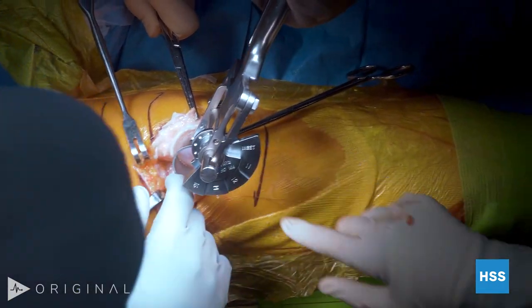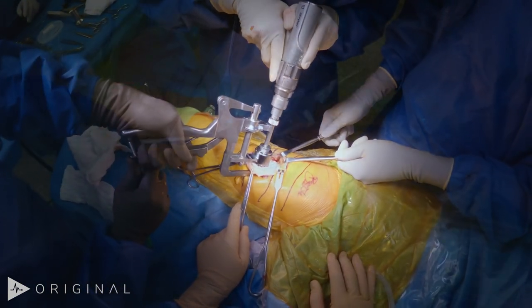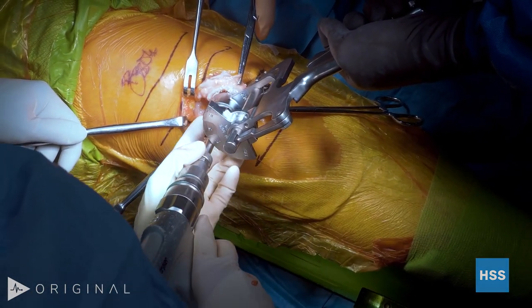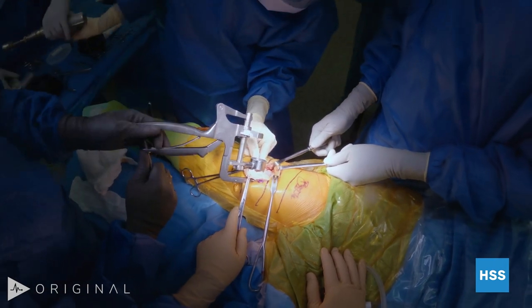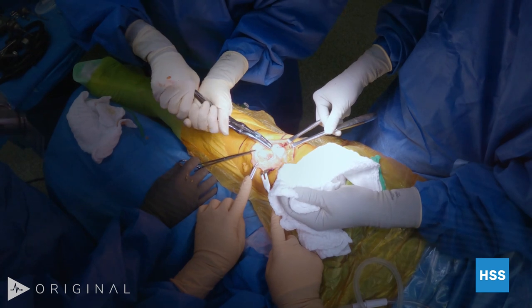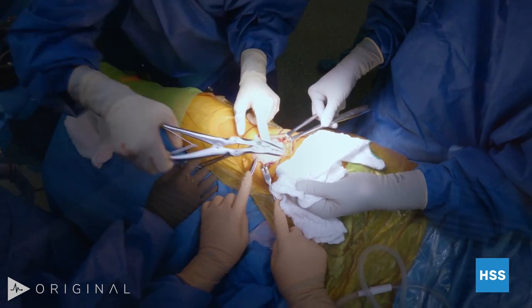You can actually feel it — it's like the central cassette right there. She's kind of carved out, and we're going to come down along that ridge. This is the reamer we use to try to be concentric, because otherwise it's challenging. We need to go one more — trying not to go to 12, leaving it at about 13. We can see the lateral already — we know this is concentric, which is great. The over-stuffing of the patella is not as much of an issue with these patients because their patella is so thin to begin with. You're reestablishing it, which hopefully helps quad function.